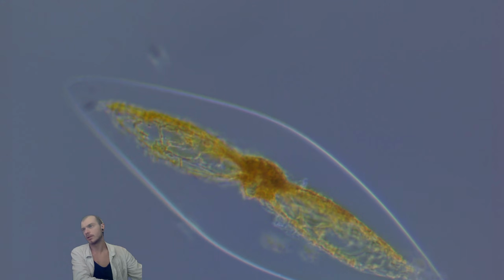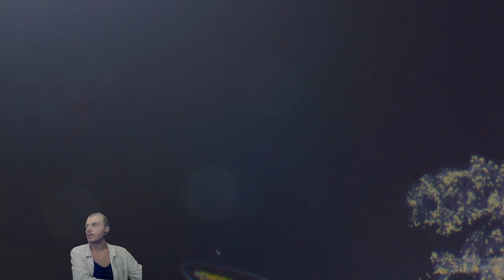This looks more likely like it's due to osmosis, which is just like the wall area is too concentrated. So maybe it needs more water, but I'm scared to add some water to them. I think it is not a good idea. But last time when I was checking it, it was glowing. So I think a lot of them are healthy.